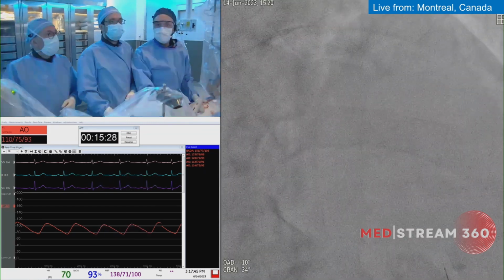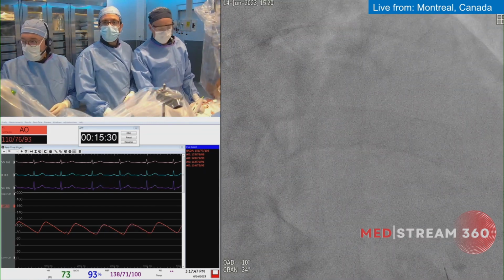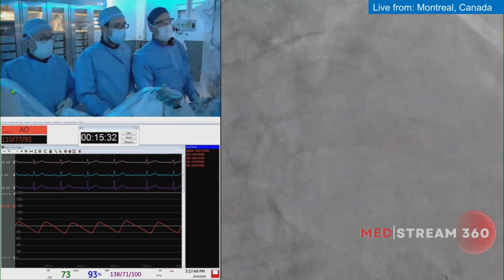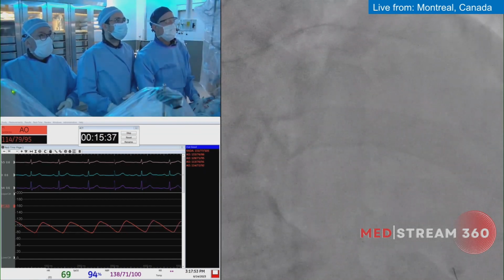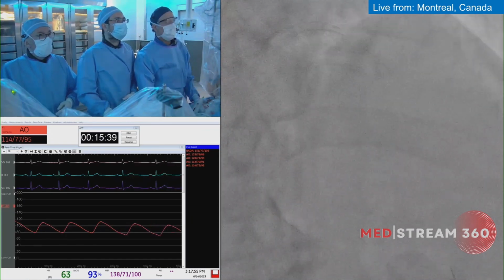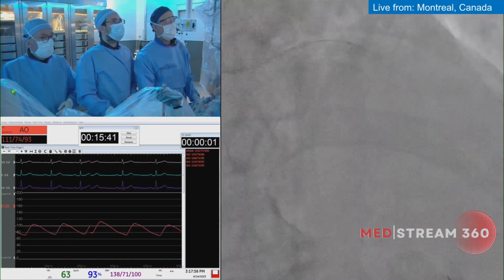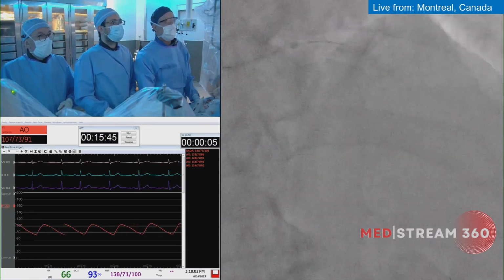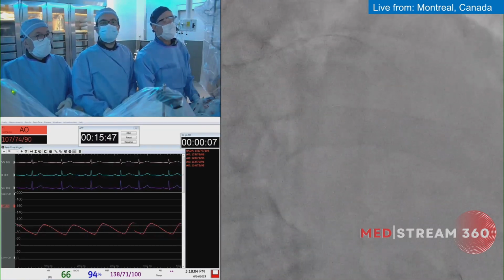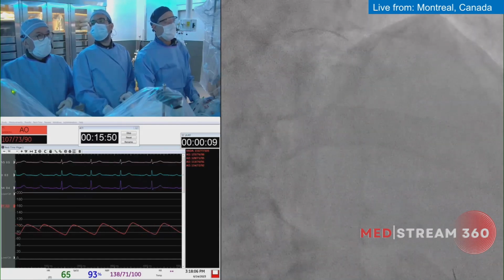Is everyone ready for orbital? Is it on? So we're going with low speed here. It's important to go 1 millimeter per second going forward. I don't know if you can hear it, but the sound is very high frequency. So we're in a lesion.